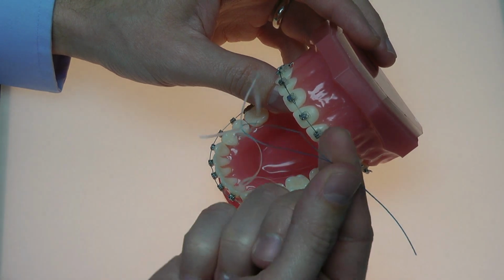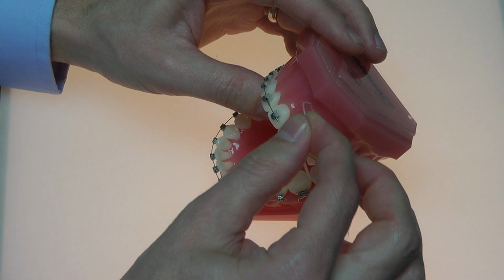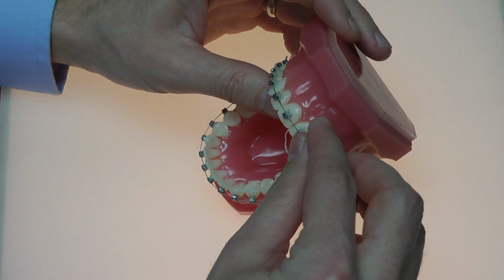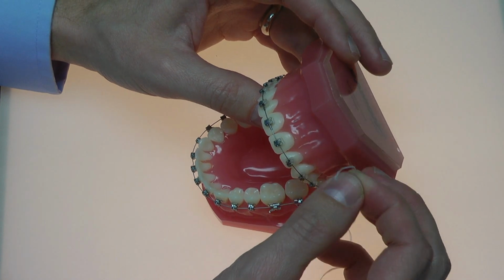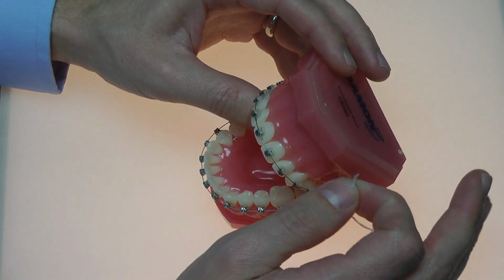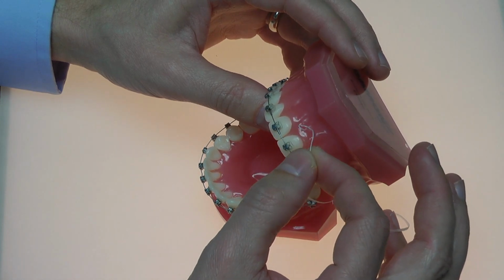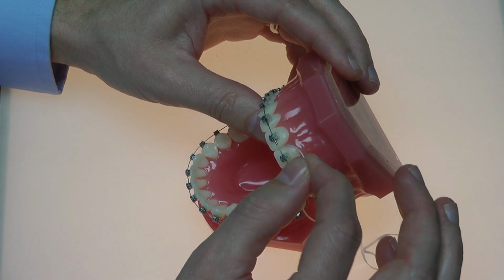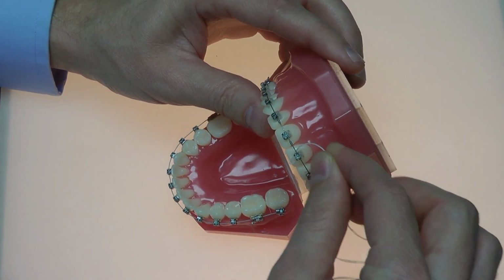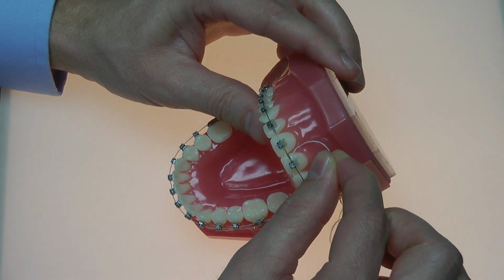Or you can just go ahead and slip the floss underneath the wire if you can. It's difficult for some people, especially depending on the floss. If you use a floss like Glide, which is really nice, smooth, I love it, but it's a very flexible floss and it's difficult to maneuver and slip underneath the wire. A lot of times it will stick to your gums and it'll be difficult to actually push it down and guide it underneath the wire.